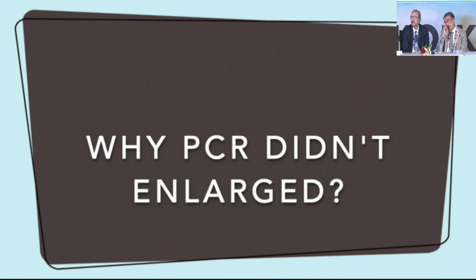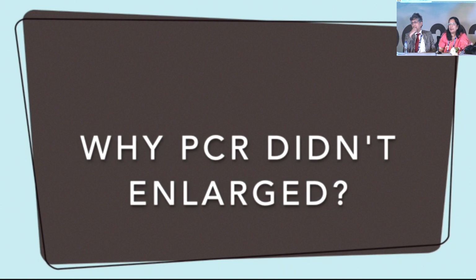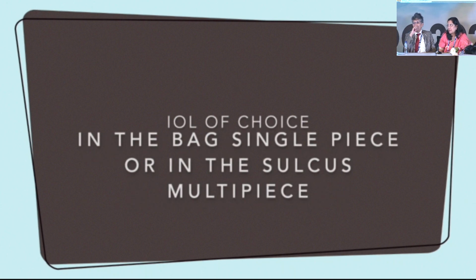See, the very fact that there is cortex in the vitreous means there is a PC which has been compromised. Sometimes, through the periphery also, without PC compromise, you find small particles of cortex in the vitreous, which you can see hanging around. But here, there is a large chunk of cortex. So definitely somewhere the PC has been compromised. One has to wait and not do any anterior segment manipulations unless you do a vitrectomy, or a posterior segment vitrectomy to clear this cortex and then go ahead, which is very, very important. Whether it was present earlier, I don't think so, because like Parikshit Bhai, I would think that there would be calcification and fibrosis around it.